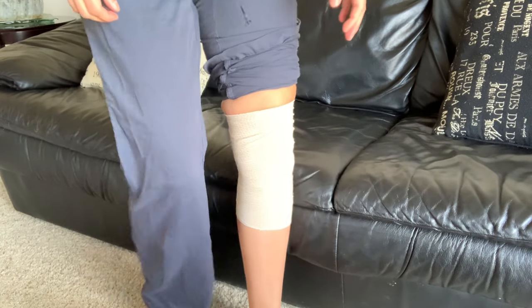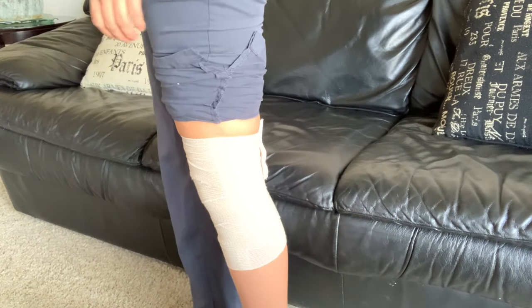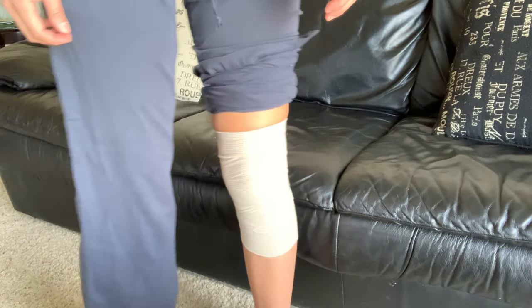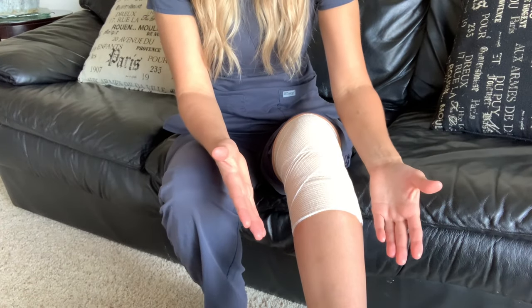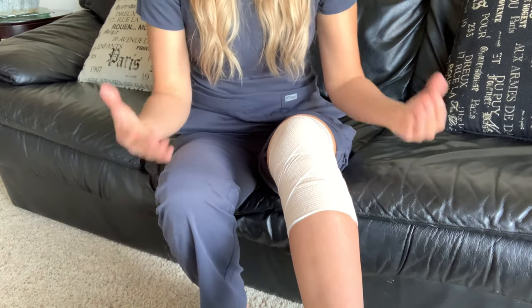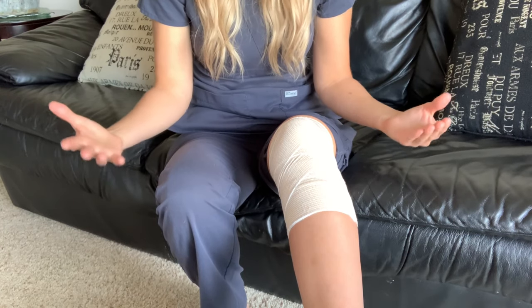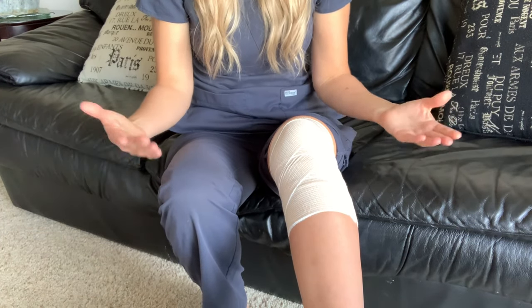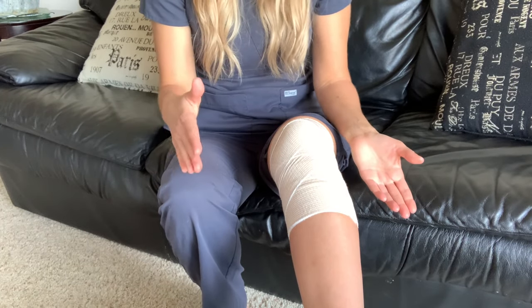That feels really comfortable on my knee — I can still move it and it feels very snug and supported. After you apply the bandage, always check below on your patient or yourself. Make sure the skin is still nice and warm with no discoloration, numbness, or tingling, which would indicate too much compression on the blood vessels affecting circulation. If that's the case, take the bandage off completely and rewrap it more loosely. Any elastic bandage should also be removed at night before you go to sleep.